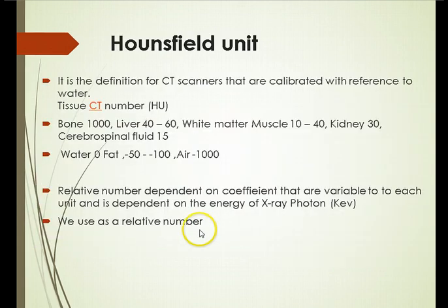So we're going to talk about the Hounsfield unit. This is what we use. Again, it's a relative number, but it'll give us a good idea to be able to predict what's going to happen on the day of surgery, and that's the goal. That's all we're looking for from radiographs, is to give us as much information so the case when I'm actually doing it is predictable, and what is there is what I already know and what I'm already expecting, so I'm prepared for it.